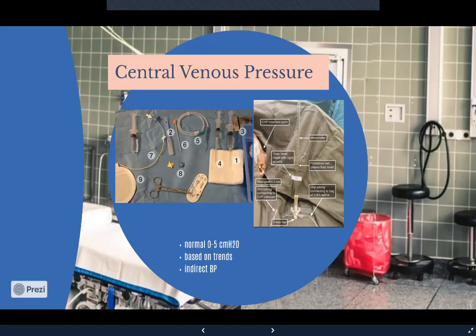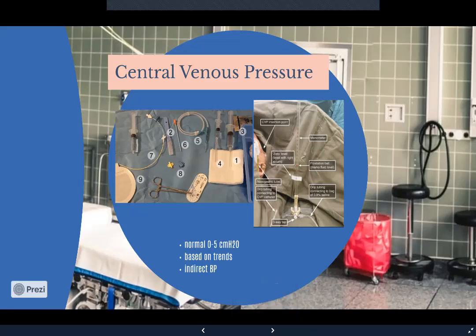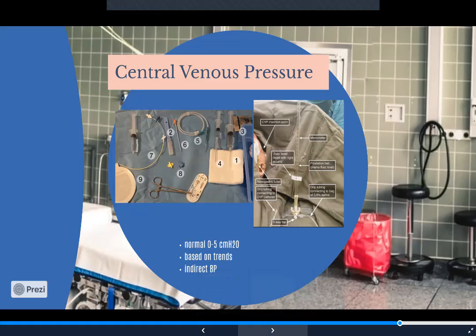You can make one of these manometers as well. I've made a ton of them over the years until I had commercialized ones, and it's really easy to make. But granted, it is based on trends because you don't always hit the same spot in every single animal. Every animal is different, but it's a good way to know the hemodynamics of each patient.